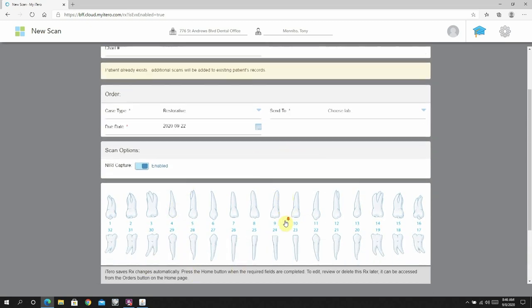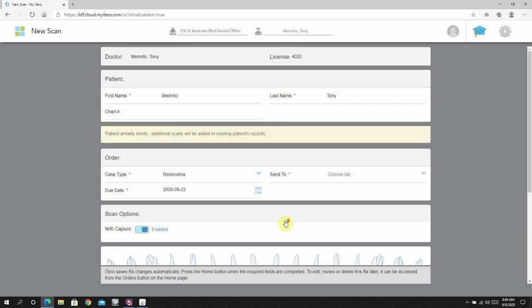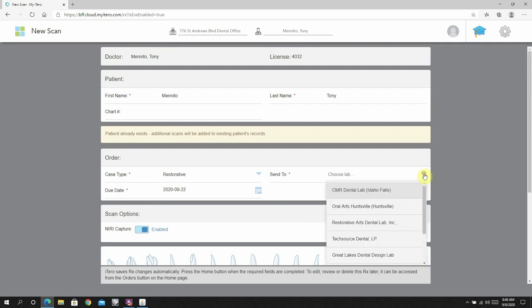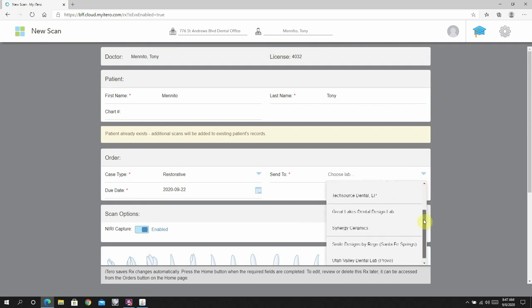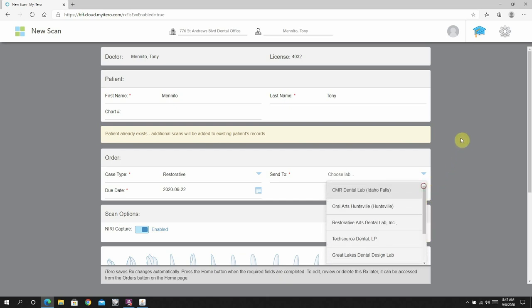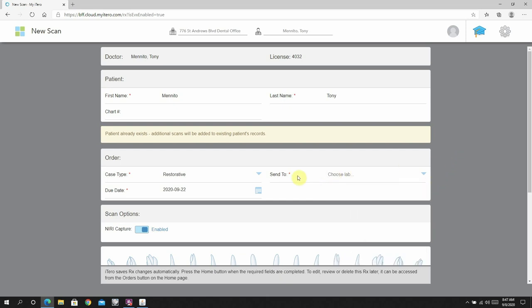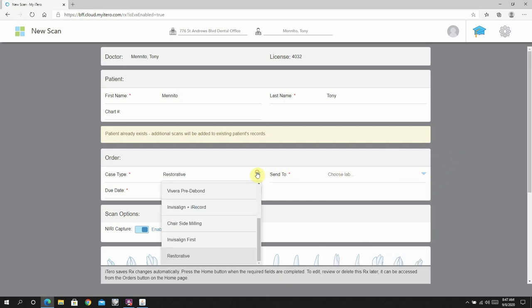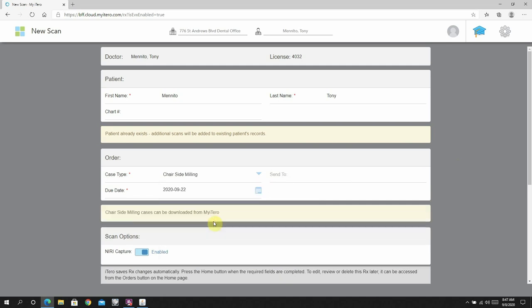If you accidentally pick restorative as the case, it basically forces you to pick a lab to send that to. And once you send that case off, you do not have access to those STLs, only the lab.